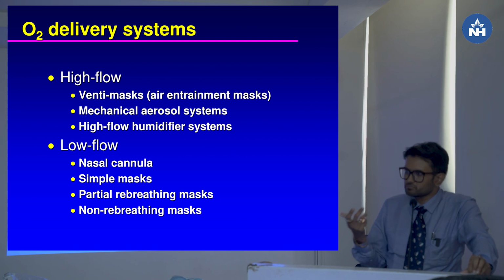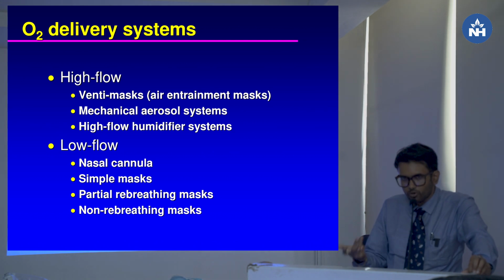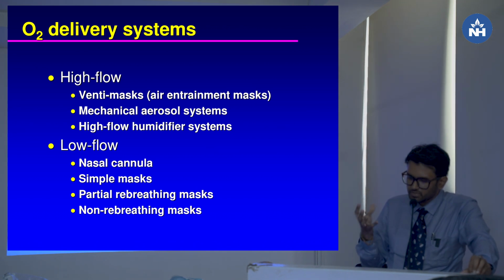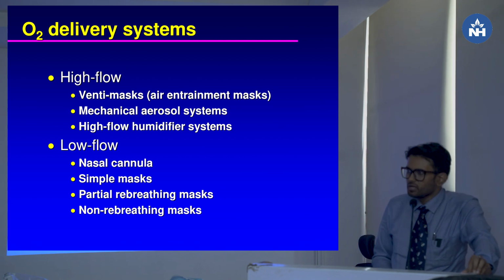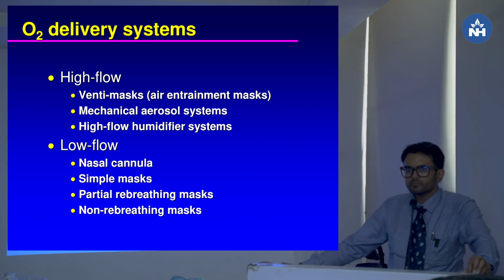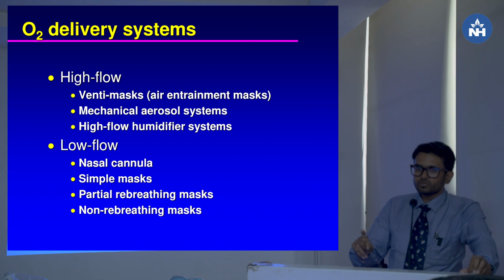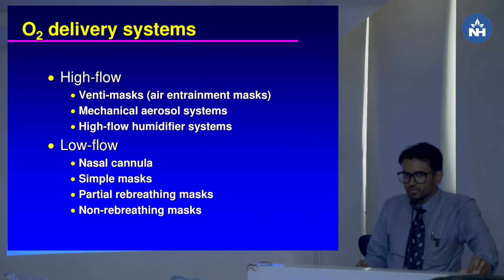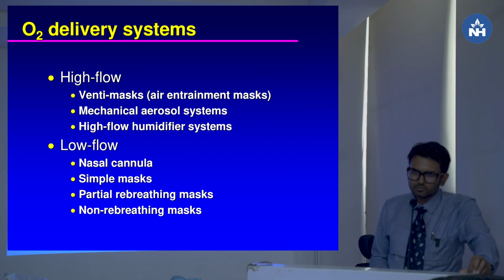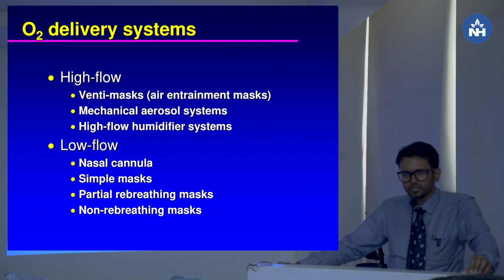If the mask gets blocked, or if we use a breathing mask and the bag is not working properly, then we have to change it. It can also work as a source of secondary infection for the patient. Exactly, so if it is contaminated, or if they get blocked, then we have to change. Otherwise there is no definite timeline, I think.